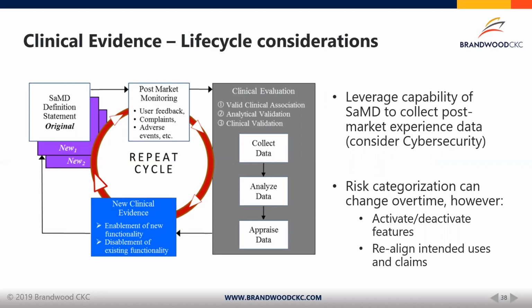And then you've got an evaluation to be made as to whether you can actually maintain the current feature set, if you're required to deactivate features, or if you need to realign your claims, possibly submit regulatory applications to basically extend uses of the device. So that's sort of a unique scenario, even though all product changes, whether that's a hardware product or software, always need to be evaluated, and the need for regulatory submission has to be assessed. With software, as I mentioned before, given the development plans, given the ease of release of this kind of device, it is often an issue, and it has to be thoroughly controlled and integrated in your development plans.